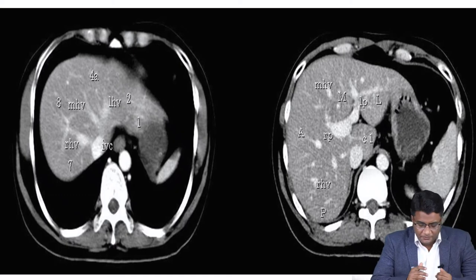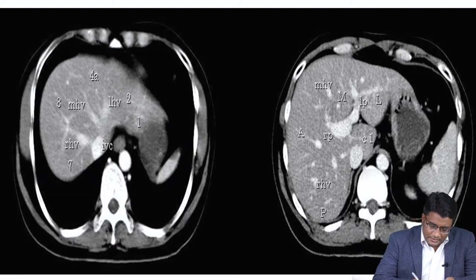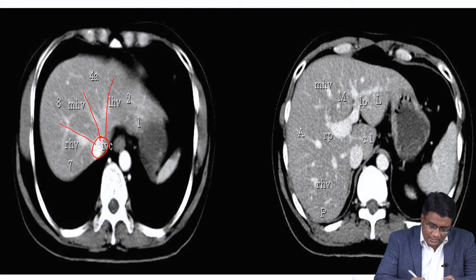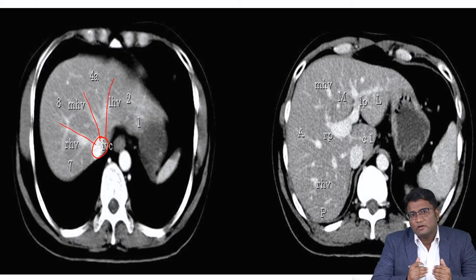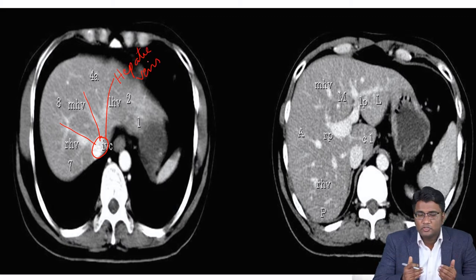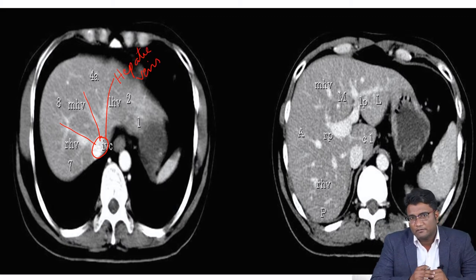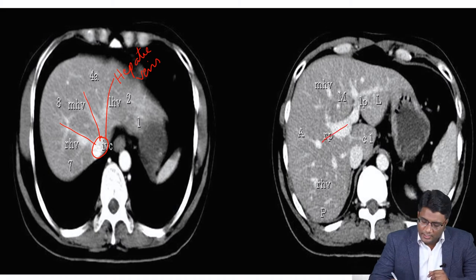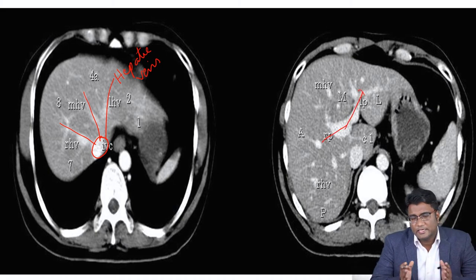Please look at this image. This is the inferior vena cava, and you can see these vessels converging towards the inferior vena cava — these are your hepatic veins. This is how the hepatic veins appear: they converge onto the inferior vena cava, whereas the portal vein travels transversely in the liver.